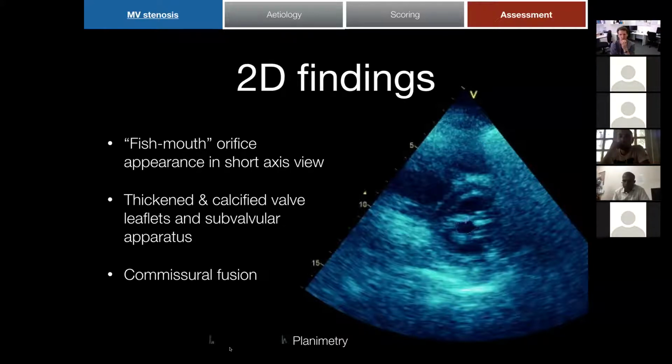Nice. It looks like maybe on this image you've got a little bit of lung shadow coming down the edge as well, which hasn't actually impacted on where you've taken the measurement itself. But it suggests that maybe there are some difficulties with image acquisition in this particular patient that might be improved by repositioning either the patient or the probe. I was going to say, the only thing I've done well is that I haven't optimized my gain, I haven't zoomed in on the image, but I've put the focus position in the right spot. Yeah, you can say that's the one thing you've done. Thank you.